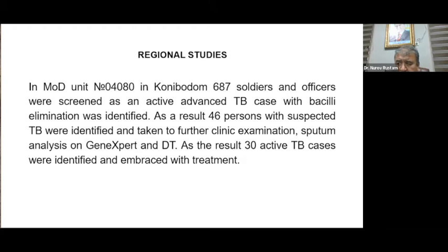Over 40 persons were suspected to have TB, and after additional clinical tests and sputum test with GeneXpert, we managed to identify over 30 cases of active TB, and at the moment all of them are embraced with treatment.